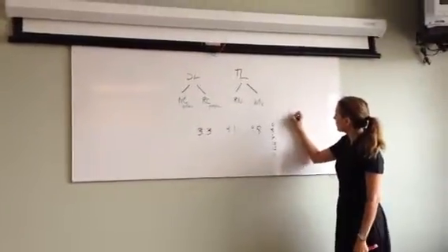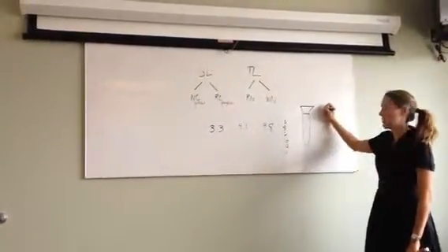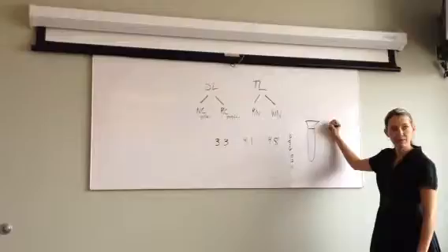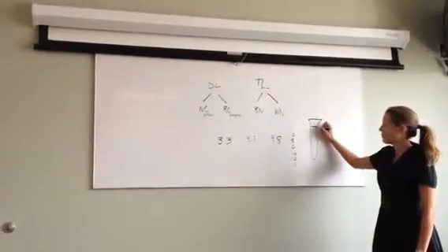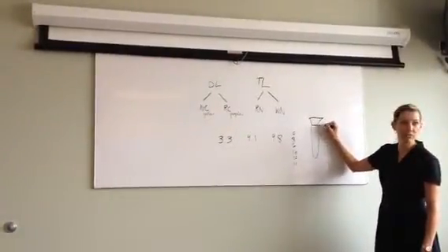If you have a tissue level implant, where is the length measured from? From the part that's in the bone. From the collar down, not from the above. Yes. So the length on a tissue level implant is measured from where the rough surface is.